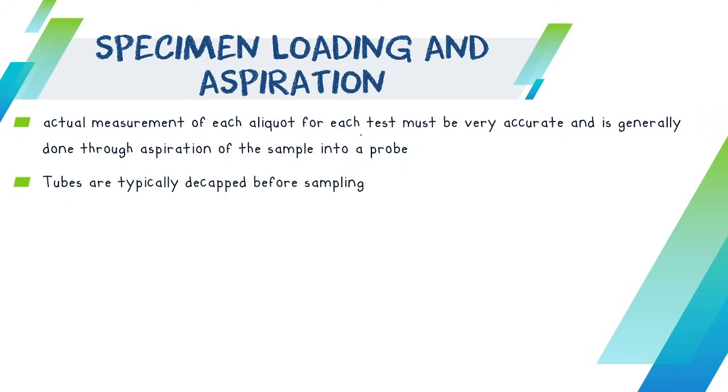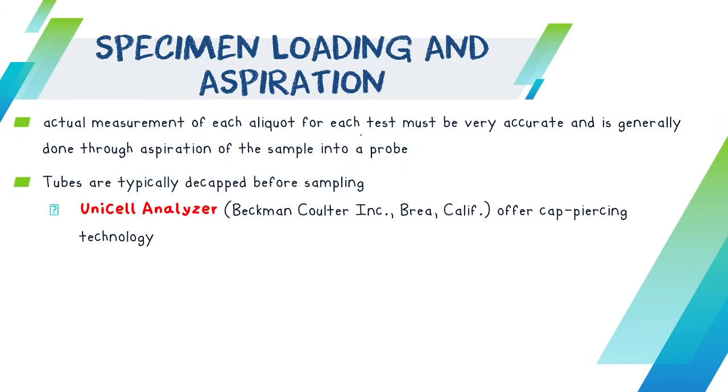So tubes are typically decapped before sampling, but there are machines that offer cap piercing technology. Sa katong nakita ninyo na video kaganina, di ba naa tay isa diri na naa tay mga auto-analyzers na sila na mismo ang nagadikap. But for some, and unsa ang most common na auto-analyzers here in Davao, kita mismo nagadikap ana.